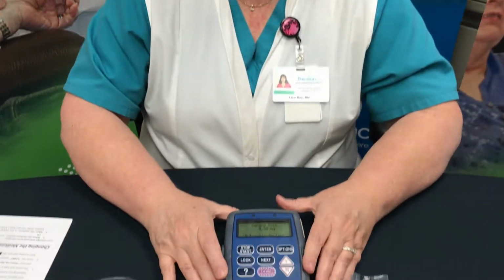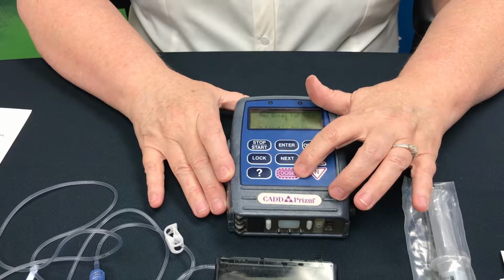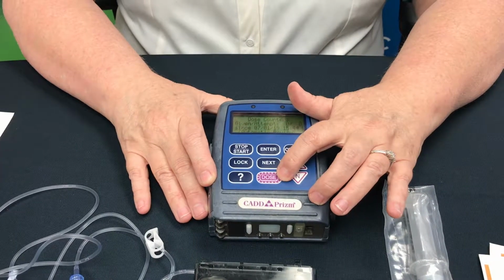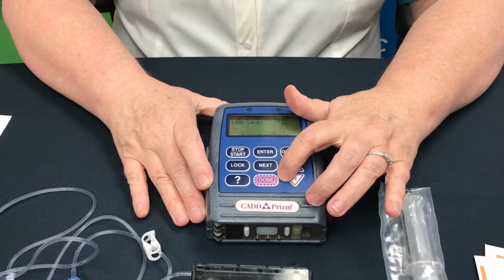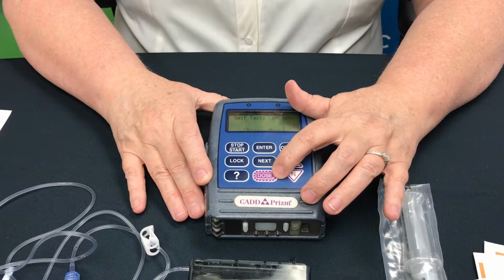On our pump, there is a dose button. You will be able to press the dose button every number of minutes that has been prescribed by your doctor. If you can have an extra dose every 15 minutes, then it will be 4 times per hour. We will make sure that you know how many times per hour you can press your dose button and how many milligrams that dose will give you.